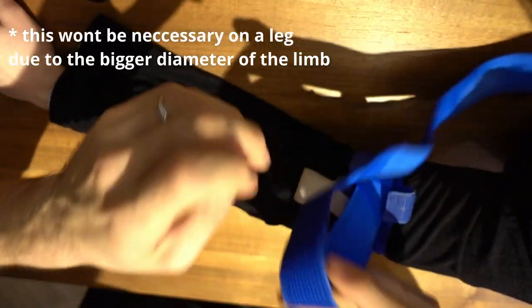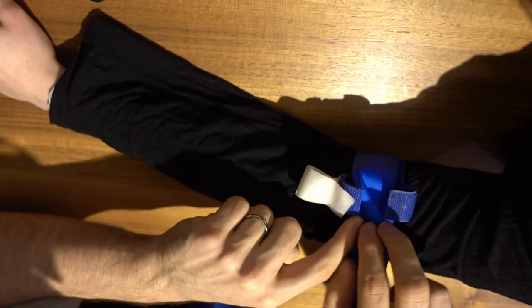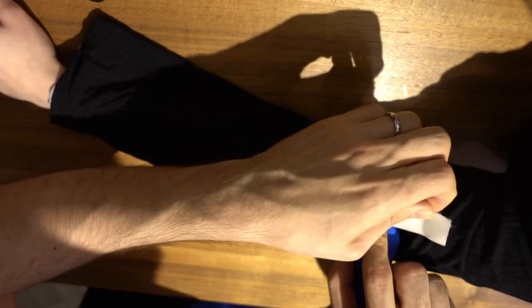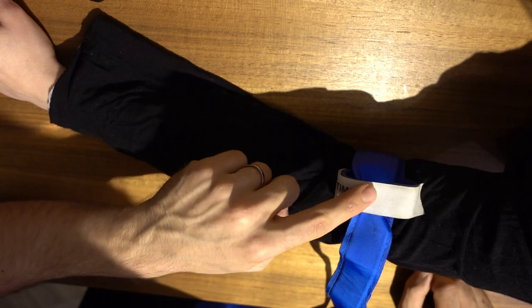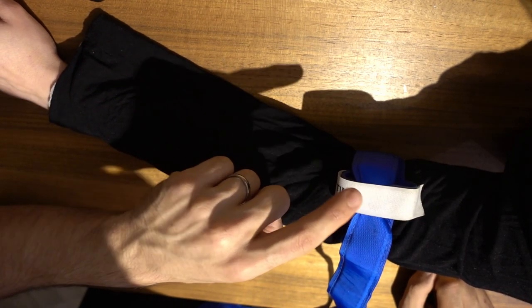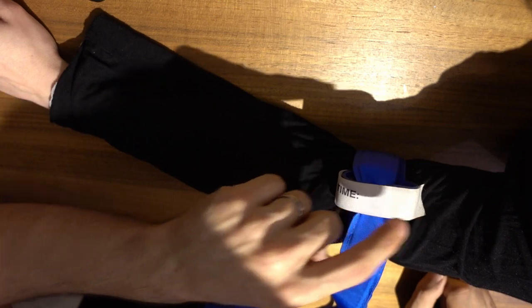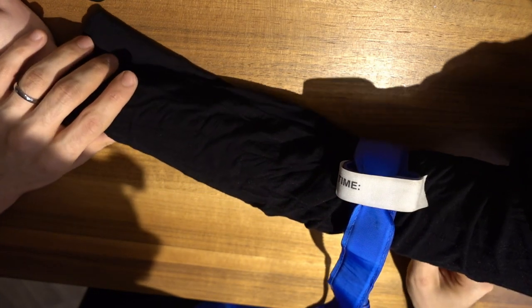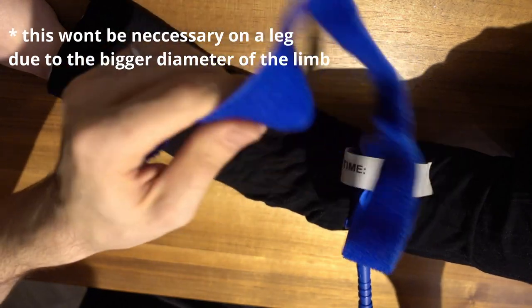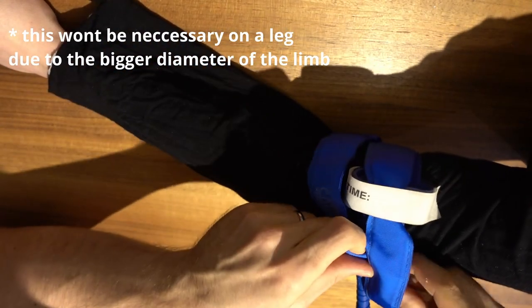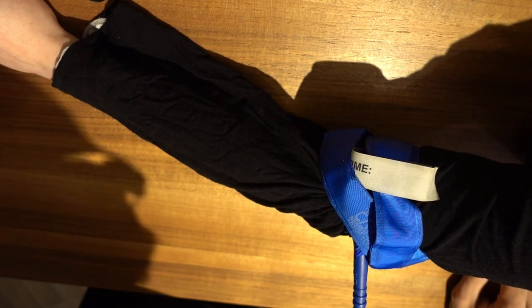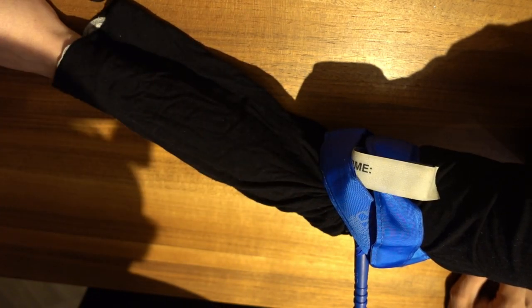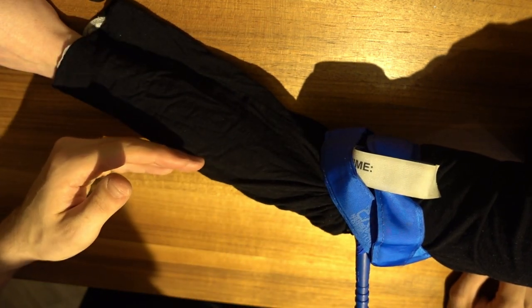The next part is you're gonna grab the velcro part here, go through those two hooks, secure everything with this little tab. If you have a pen, mark the time so the person that will remove it knows when it was applied, and that's valuable information for them. Now you have this big dangling part. You just want to wrap it around, go through here once so it doesn't get in the way. Now it's completely applied and it's restricting blood flow.